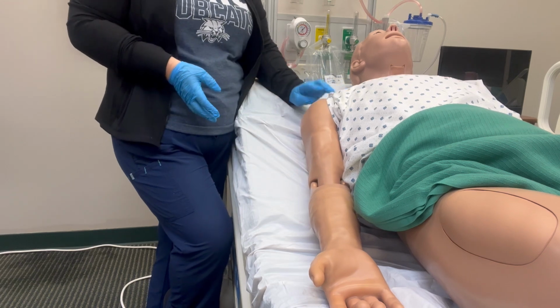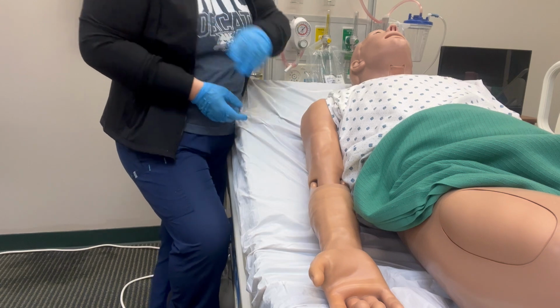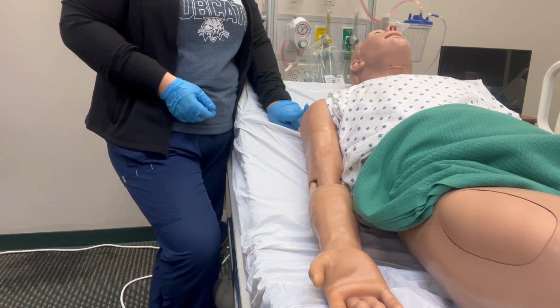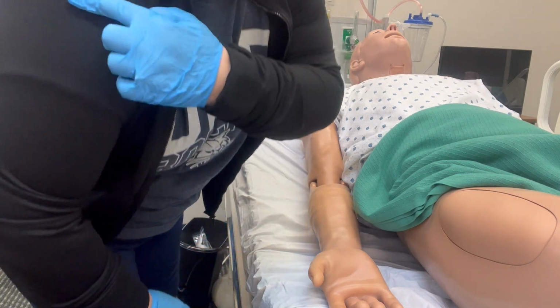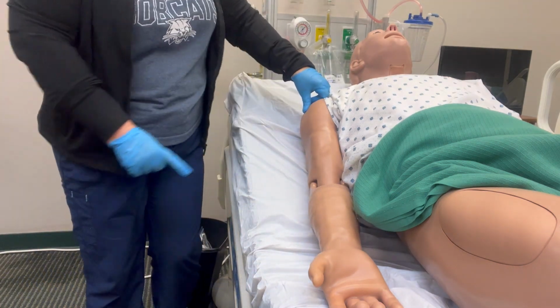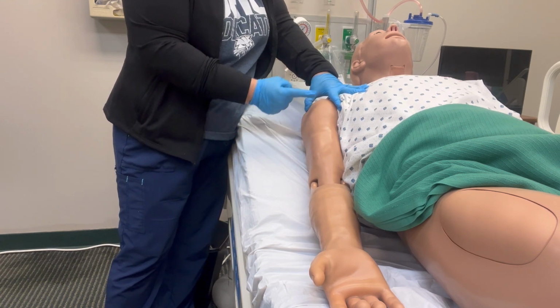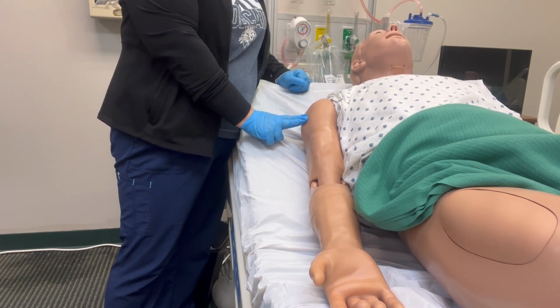For this injection, we're going to find the acromion process. The acromion process is basically the rounded part on the end of your shoulder. So you're going to locate that, and that's going to be the base of our triangle. We're going to find that, and it's going to make a line across there. And then we're going to find our axillary line, and we're going to form a triangle from here to here. And then in the middle of that is where we're going to give our injection.